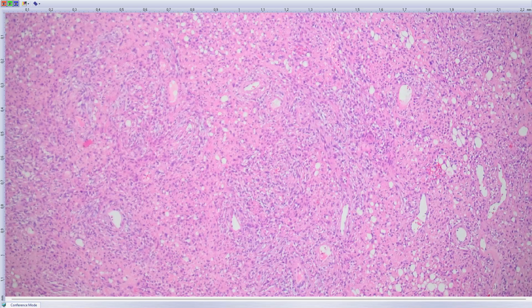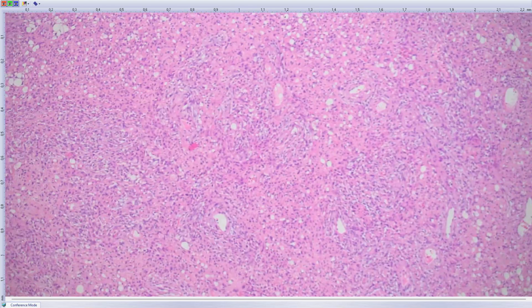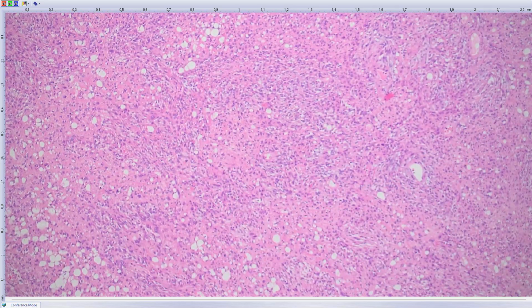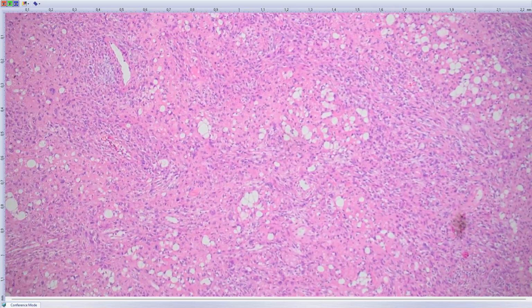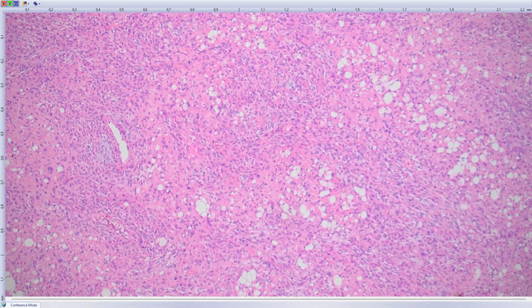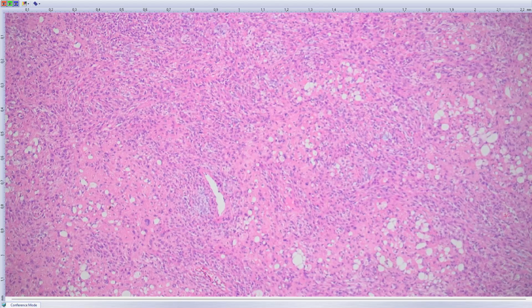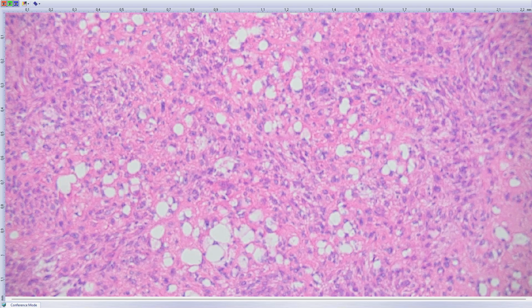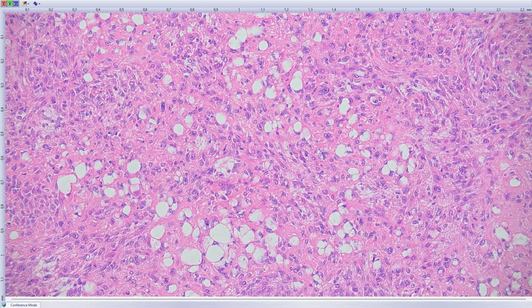You can clearly appreciate that the tumor was pretty cellular. It was composed of at least two components, with parts being formed by spindle-shaped cells, and then the sort of unusual or worrisome feature was the presence of such microcystic or eosinophilic epithelioid areas, which we may use high magnification to show.